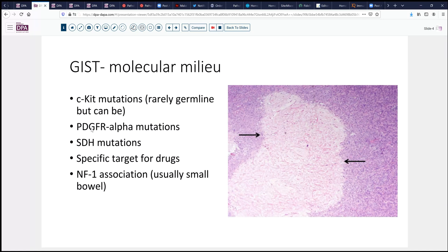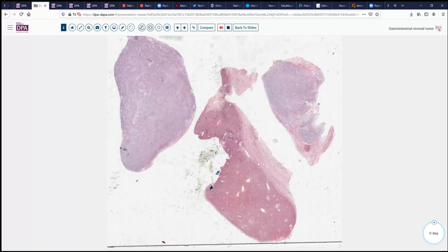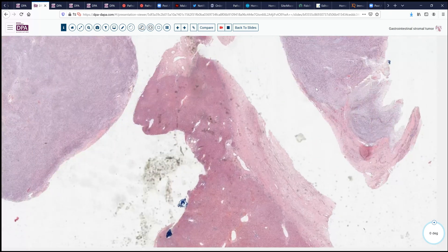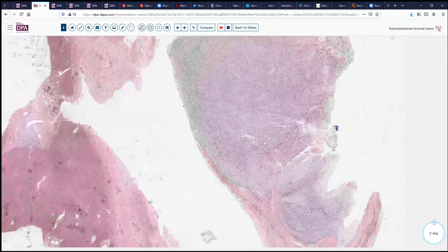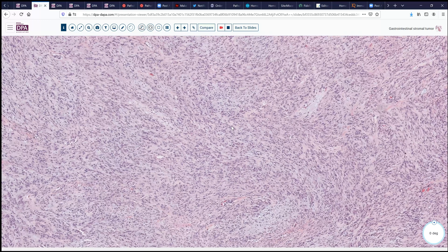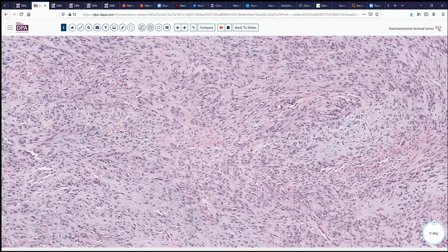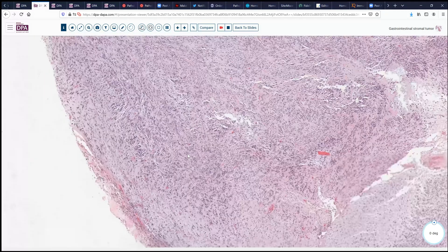When do you do mutation testing? If your markers are negative and you have typical morphology, that's certainly a good indication. If you've failed frontline therapy, that's certainly another good indication. And also the epithelioid cell type sometimes is itself an indication to do mutation testing. These tumors can present outside the tubular tract in rare instances. Here's an example of a case that presented in the diaphragm, and you see here typical spindle cell morphology — it looks just like a GI stromal tumor, but you'd have to wonder, is this a solitary fibrous tumor? Is it some other sarcoma? So including these lesions in the differential for spindle cell tumors outside the tubular tract is also important.